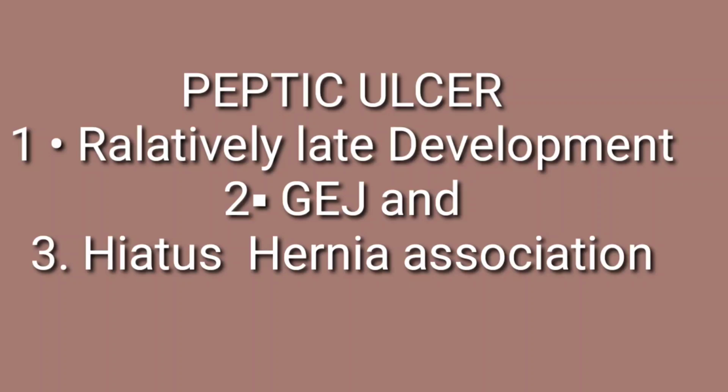In peptic ulceration, it actually develops in later life, and it seems to be associated with hiatus hernia. The area which is usually involved is the esophagogastric junction. You will see ulceration there, and there will be a particular presentation on the barium studies, which I will show you in the next slide.